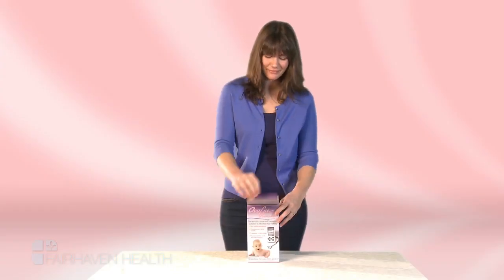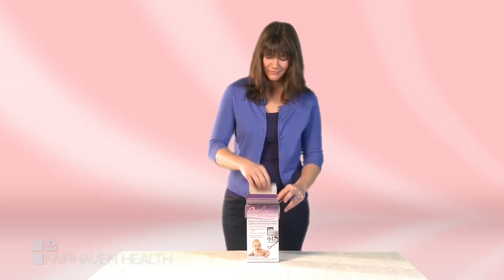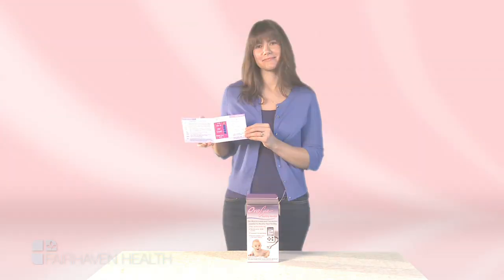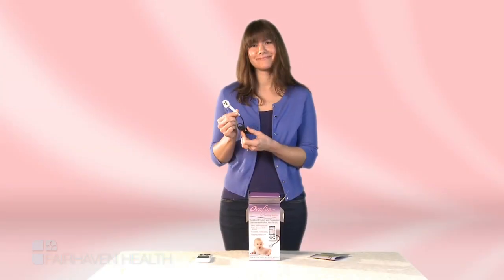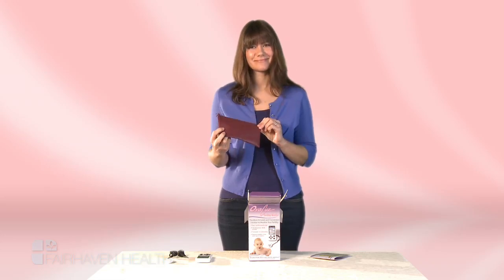The OvaCue monitor is easy to use. It comes with a full instruction manual which describes how to set up your personal fertility monitor and interpret your results. Your OvaCue monitor will include the monitor itself, as well as the oral sensor. A convenient carrying case is included as well.